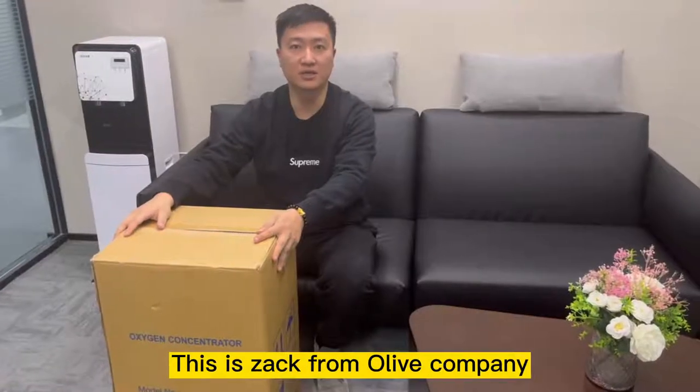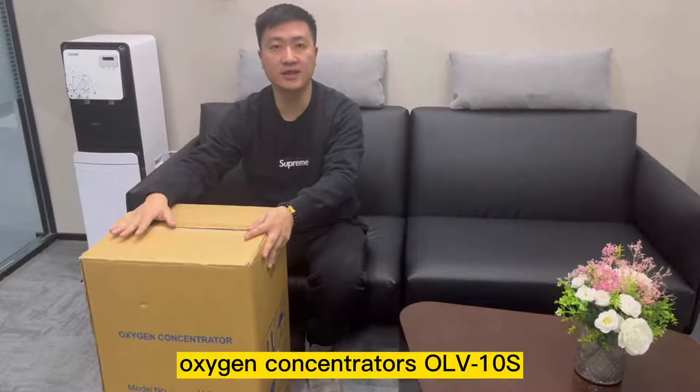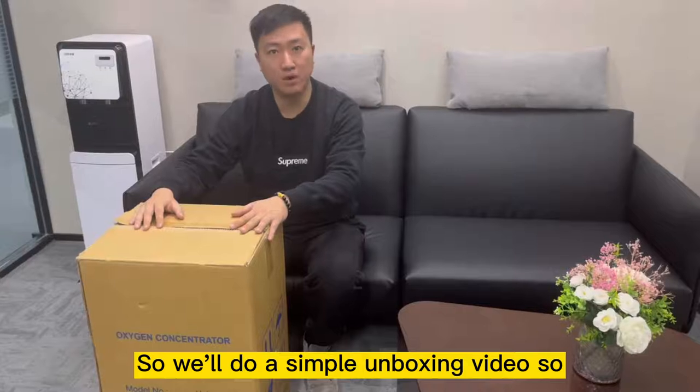Hello everyone, this is Zach from Olive Company. Today we'll do a short introduction of our Medical Oxygen Concentrator, the ORV10S. We'll do a simple unboxing video.